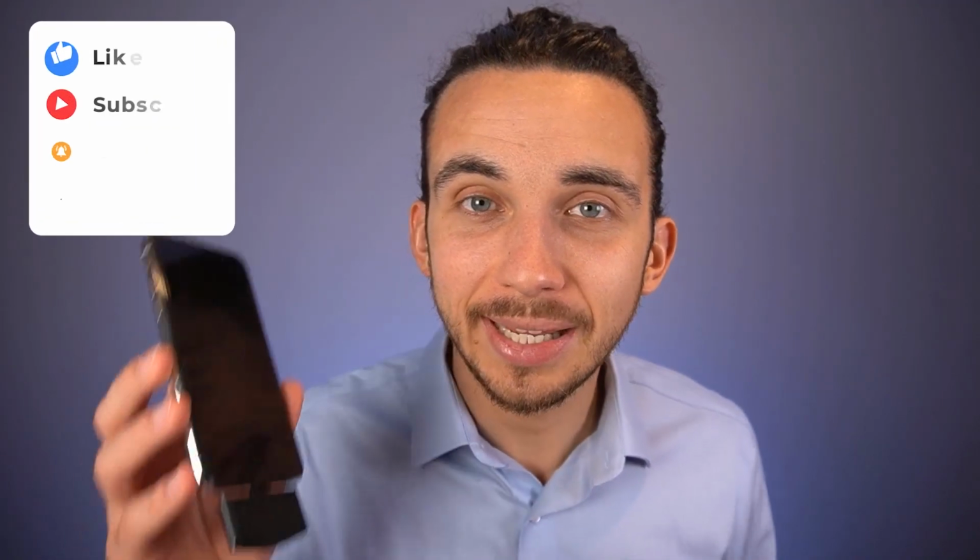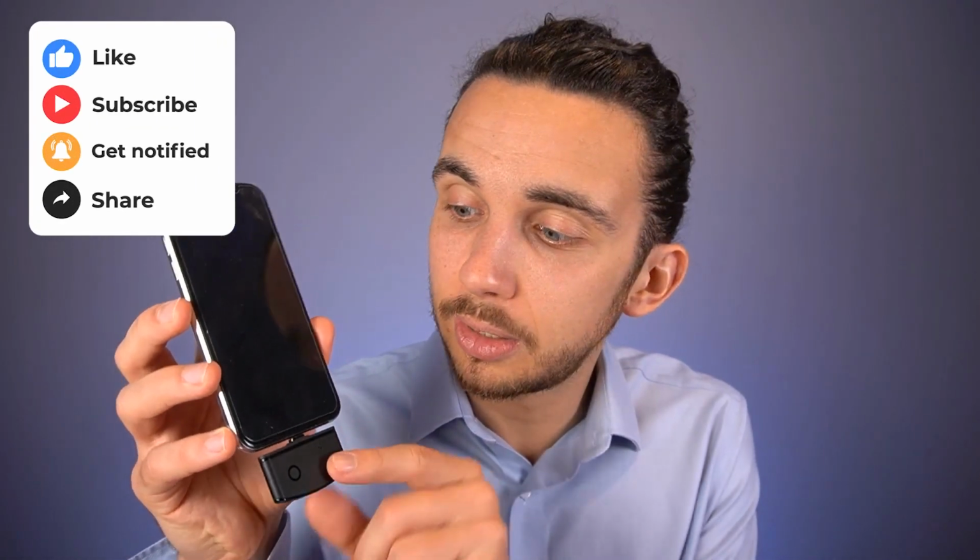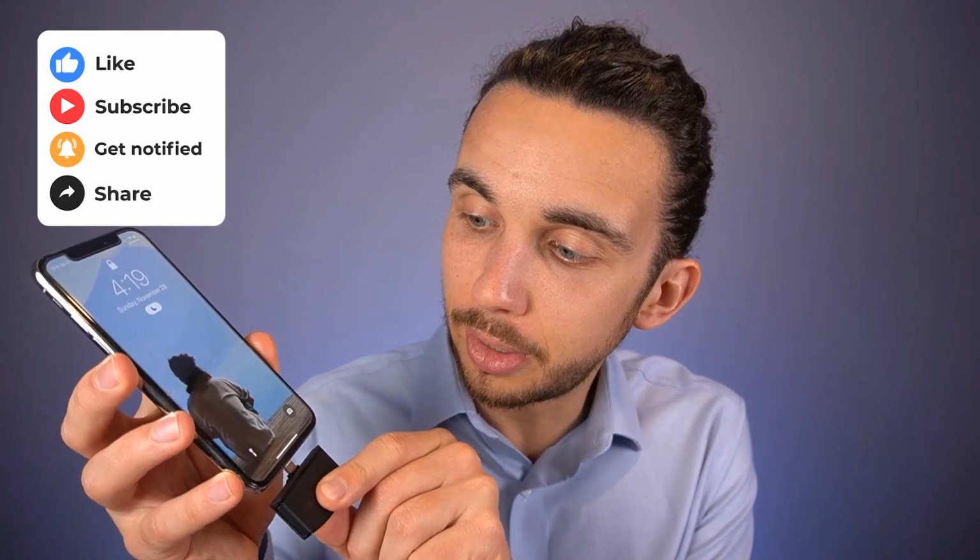Let's start by explaining how to use the Noopl. You can see here that I plugged it into the bottom of my iPhone, and that activates it. You would go through the process of downloading the app and then connecting it to whatever you're putting inside your ears. This will only work with Apple AirPods Pro or certain kinds of hearing aids that are called made for iPhone hearing aids. I'm going to explain how to set it up for the AirPods Pro and then explain what kind of hearing aids work with it.